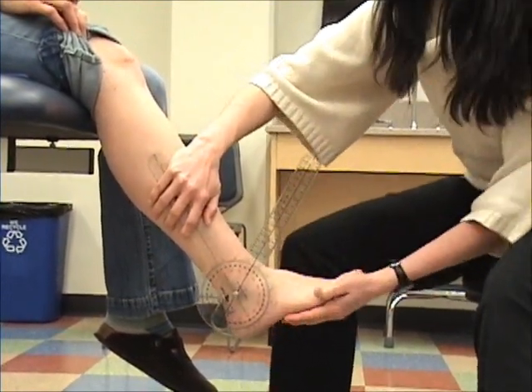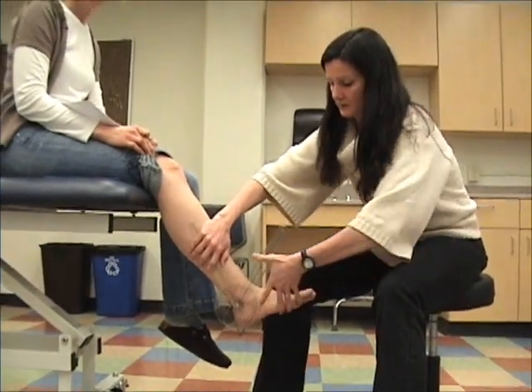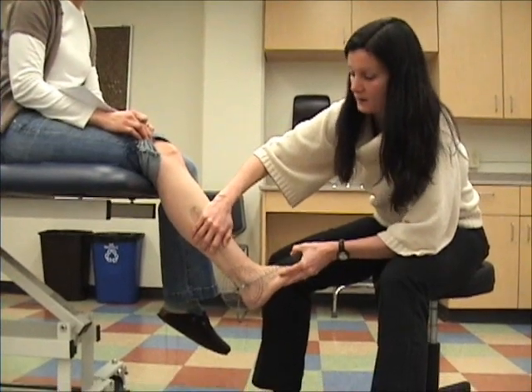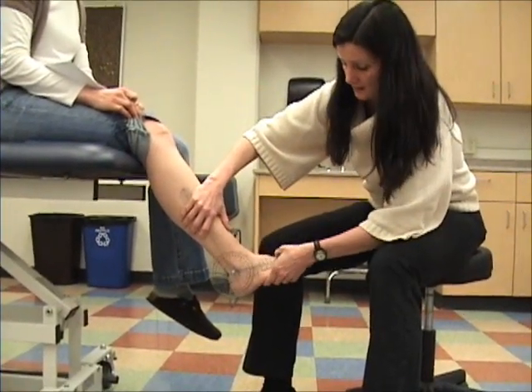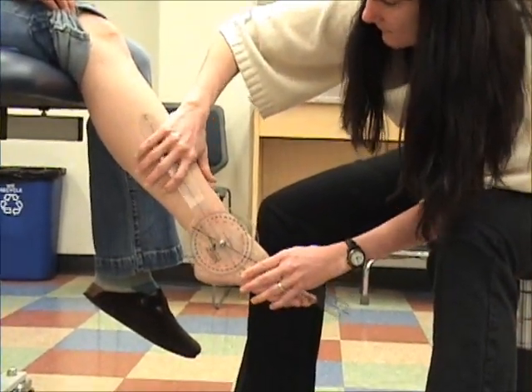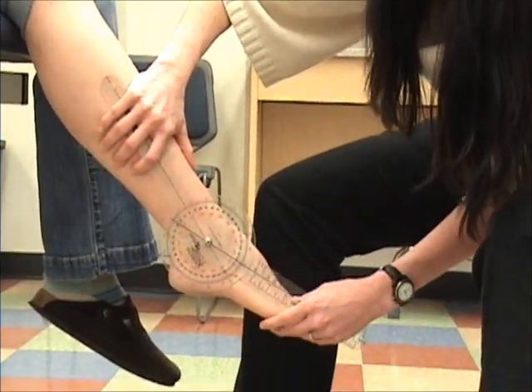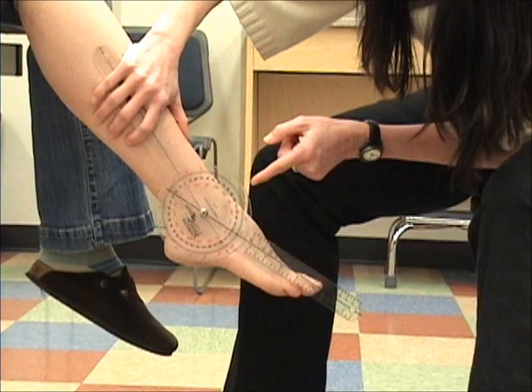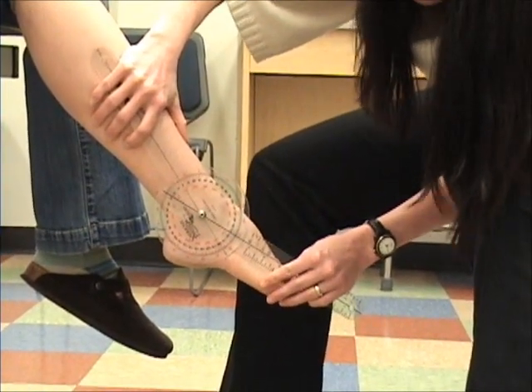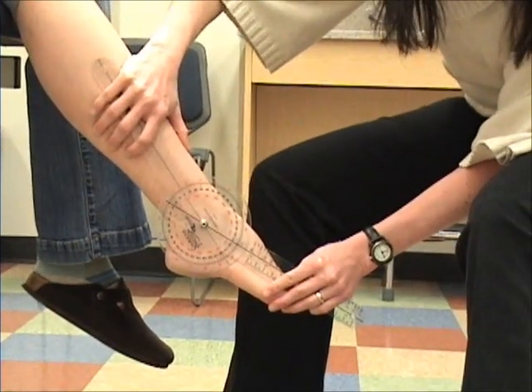Normally you're going to get about 15 to 20 degrees, I think, as written on your sheets — so that's more normal. The same reference points apply for going into plantarflexion; you're just going to take that in this direction. Remember your starting point is 90 degrees, or you're using the outer numbers, which has her at about 60 — looks like 64 degrees of plantarflexion.